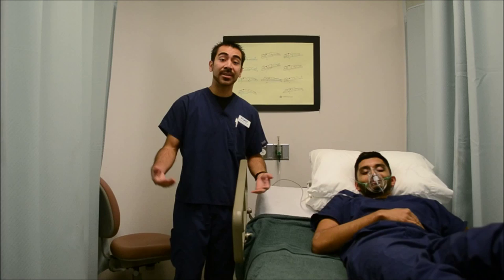I've now set it at 10. Mr. Venamoncon, how are you feeling now? That's good. Alright you guys, that's it — SimpleMask. Simple, right?